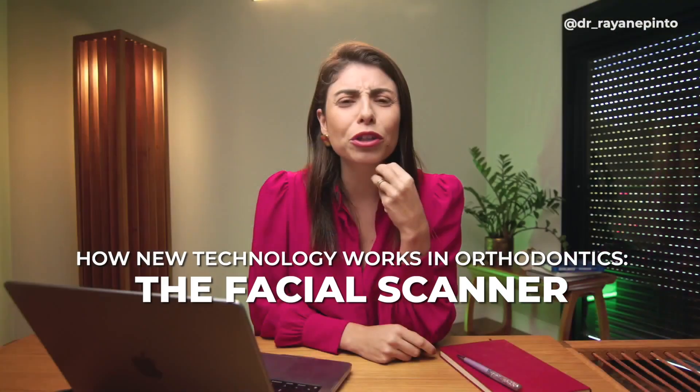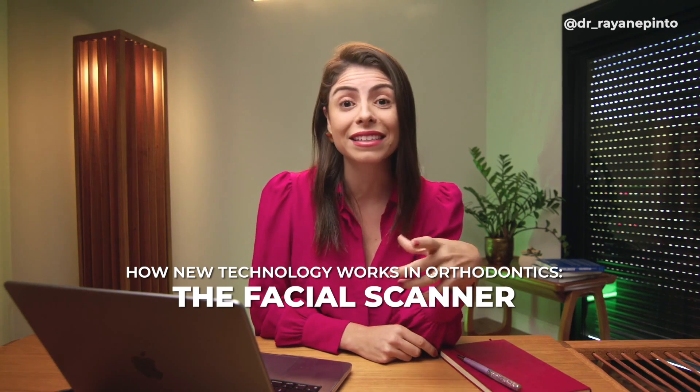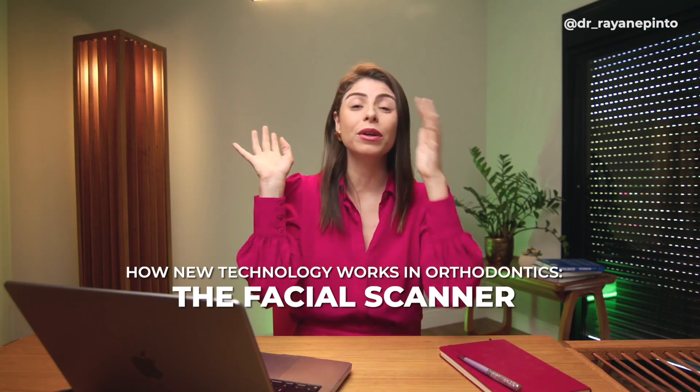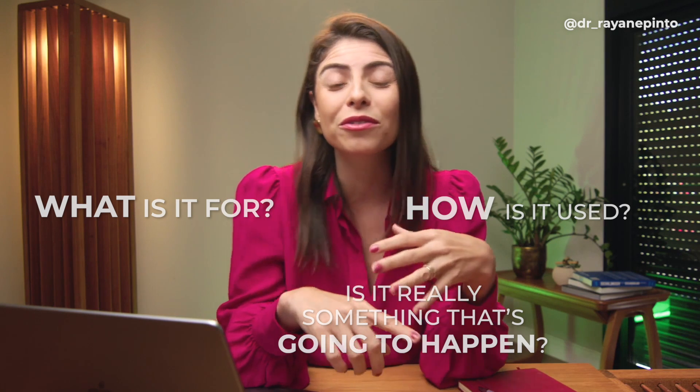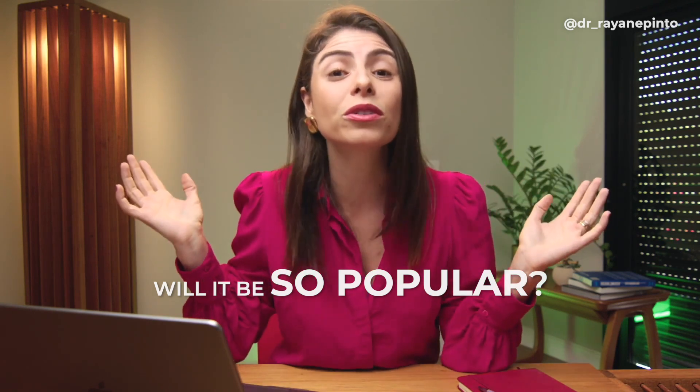How does this new technology work that is now being launched in Latin America and is already super famous in Korea — the facial scanner? What is it used for? How is it used? Is it really something that will become part of our routine in orthodontics? Will it be as popular as intraoral scanners? Watch this video because it's our mission to stay as updated as technology is advancing every day.